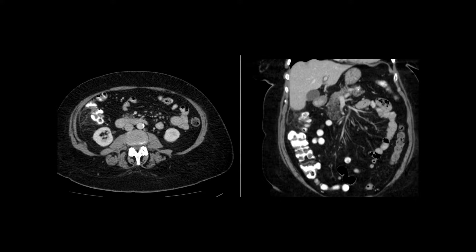This is a different patient who presents with symptoms very similar to appendicitis in the right iliac fossa. Not only is there an ovoid fat containing structure with surrounding fat inflammation, but you can see there is a central linear structure which represents a thrombosed vein.